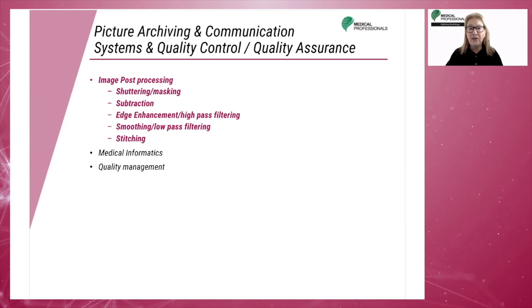The functions that are listed here are just some of the software adjustments that can be used by radiographers and radiologists with digital imaging. It is important for the radiographers to follow their institution's protocols when employing any of these software functions. The function and capability of all digital imaging systems are similar, but may use different terminology depending on the vendor.